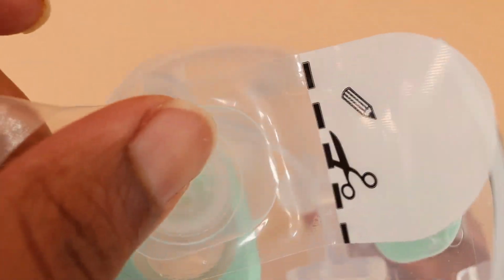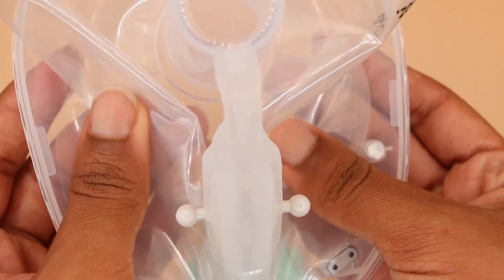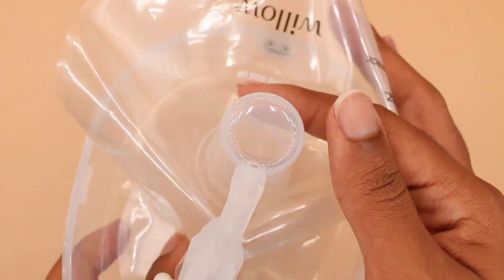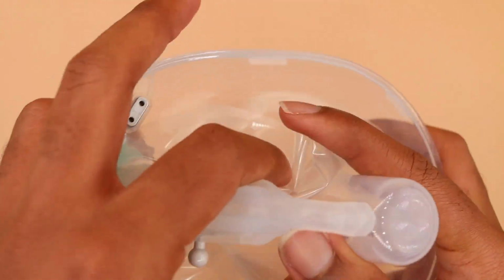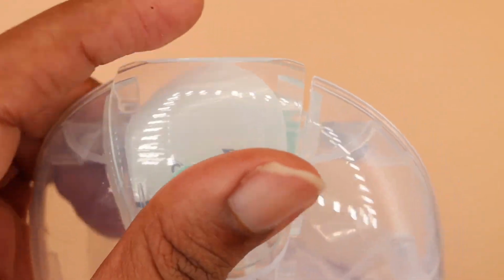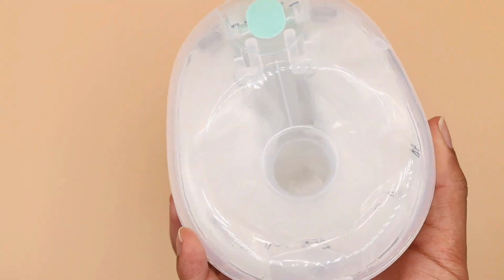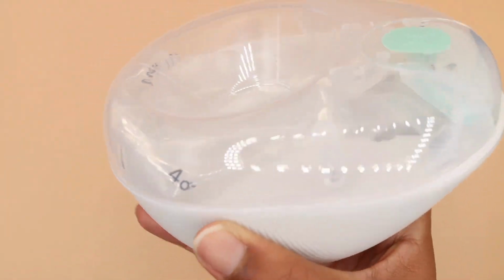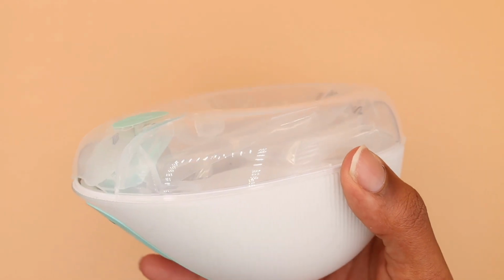So now you take your 4-ounce bag and you attach it to the flange and the flex tube via this hole here. You flip it over and you make sure you securely place the bag behind these 2 prongs, and fold the bag into the flange, close the hood or the top, and then attach it to the pump. So it's very straightforward, and as you can see here, this is how your milk will be expressed and stored in the pump.